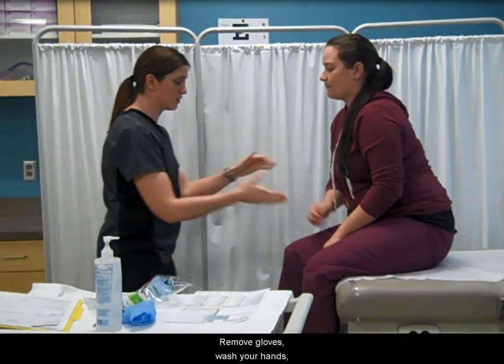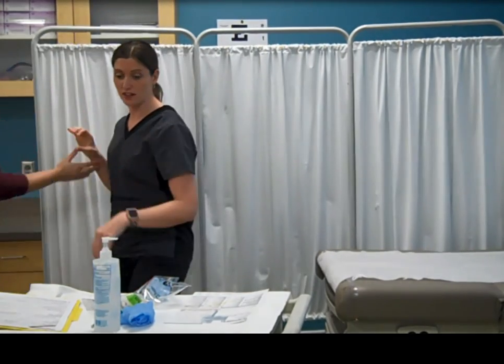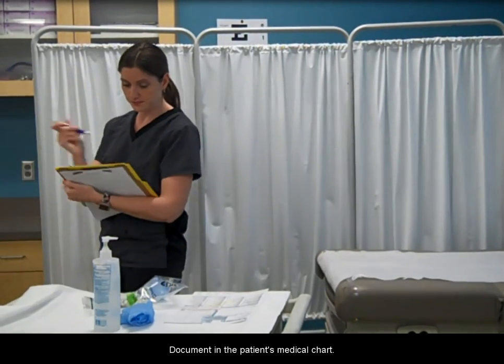Remove gloves, wash your hands, and assist your patient if they need help. Document in the patient's medical chart.